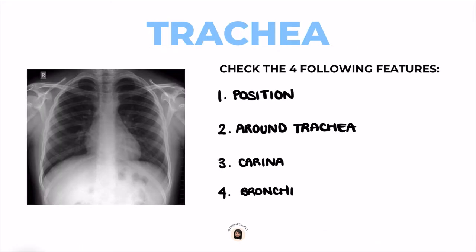Let's start with the trachea. We look for four following features. Number one, the position — check whether the trachea is central or deviated. Number two, look around the trachea for any paratracheal masses or lymphadenopathy in the case of malignancy. Number three, check the carina, which is the bifurcation of the trachea, and is an important landmark for nasogastric tube placement. Number four, check whether you can see the right and left main bronchus.